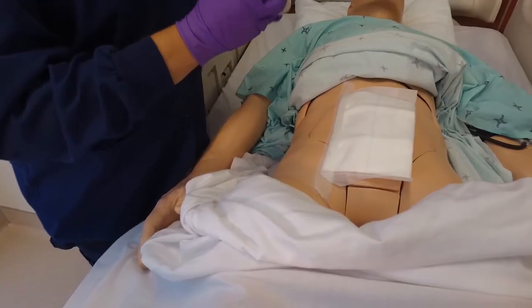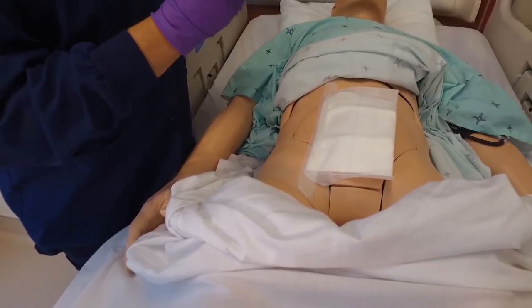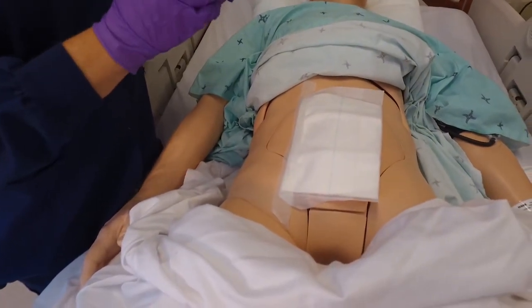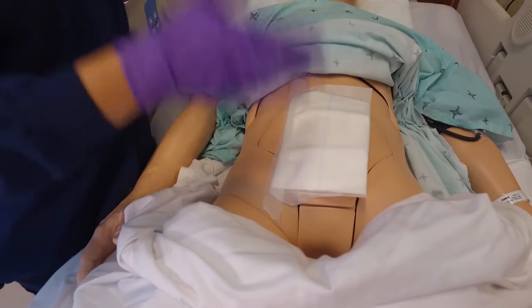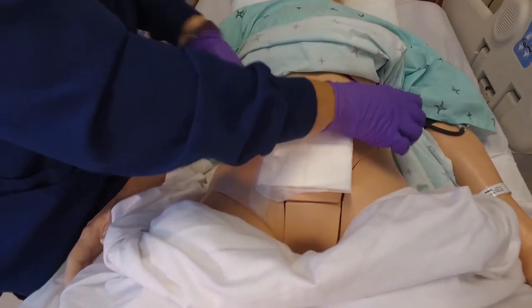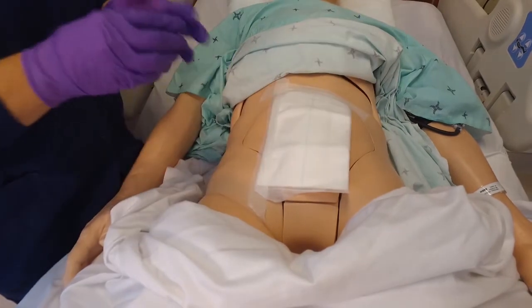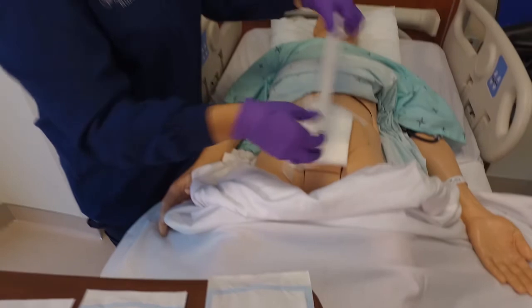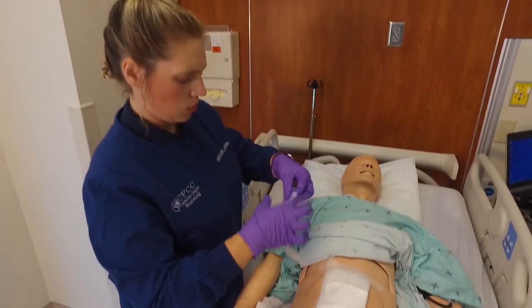She must be careful not to use excessive lengths of tape to avoid client discomfort, but must ensure that there is no gap between the dressing and the skin. An alternative method for securing the dressing would be to use Montgomery straps.